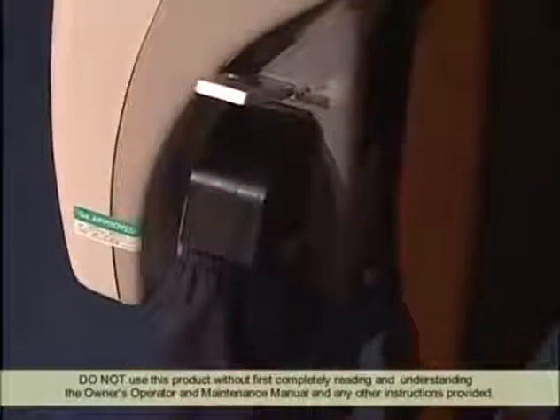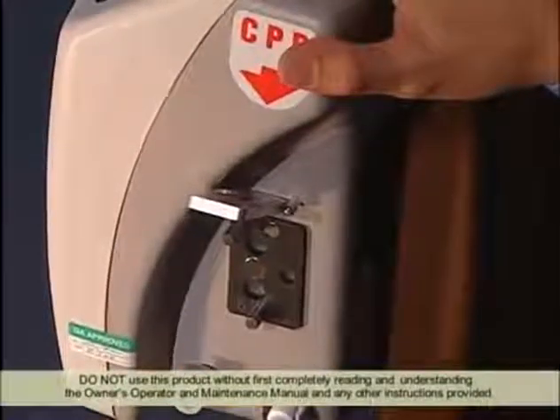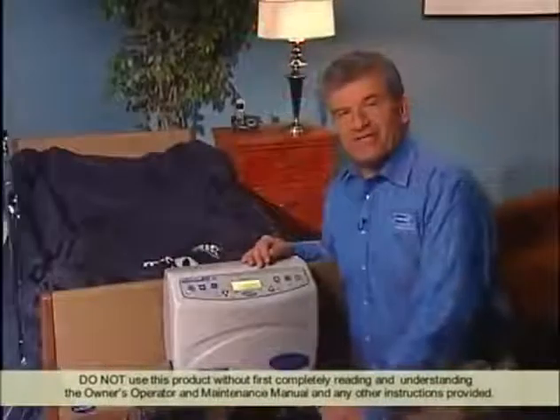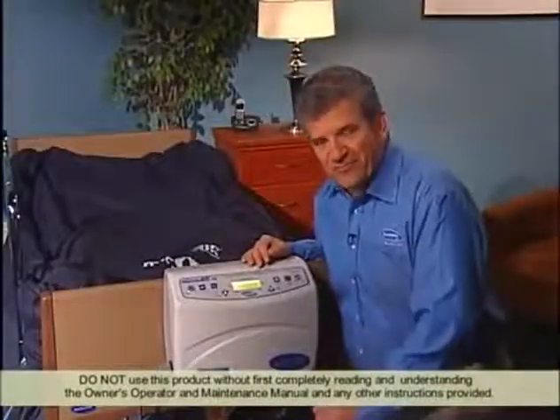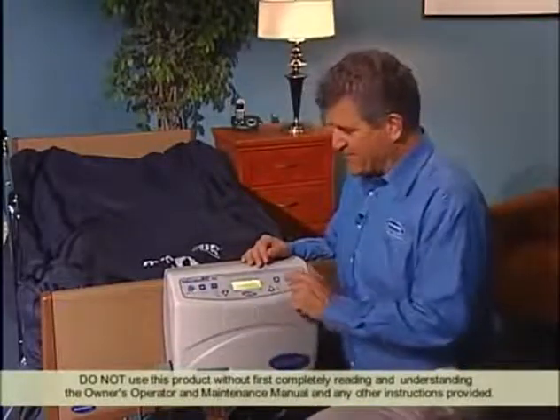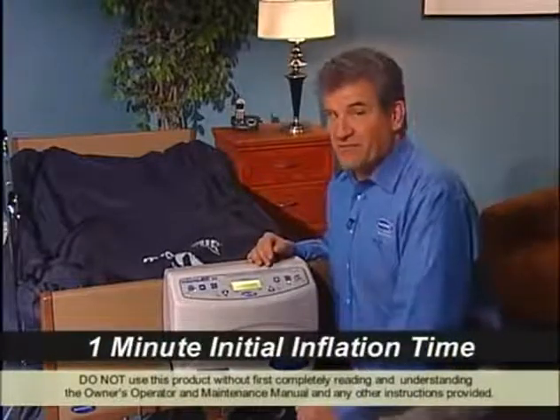In the event of an emergency, disconnect the hose as the CPR release. Just pull it off and the air will escape very quickly. Now it's just a matter of inflating the mattress. On the control panel, press power on and the max inflate button. It'll only take about 1 minute for an MA95 mattress to fully inflate.